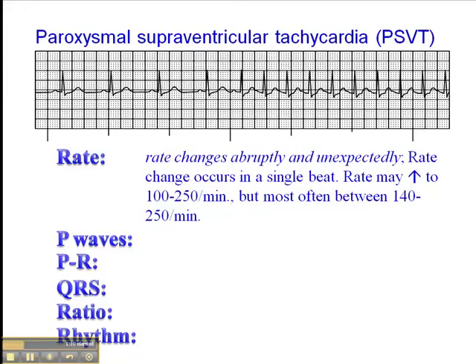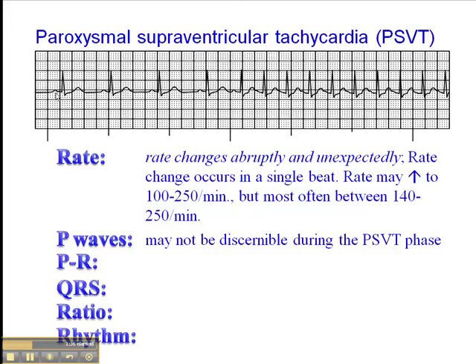The rates may increase to 100 to 250 beats per minute, but most often they're between 140 and 250 beats per minute. The criteria is that the tachycardic phase can be as slow as 100 beats per minute, as long as we see that abrupt change. The P waves may not be discernible during the PSVT phase, but they're visible here during the sinus rhythm phase, and the PR interval is normal where the P waves are discernible.